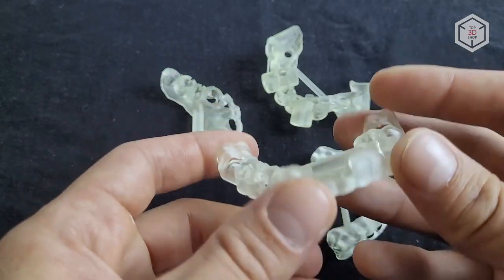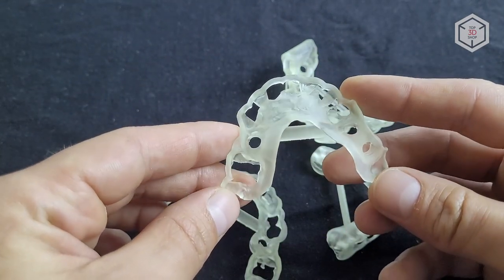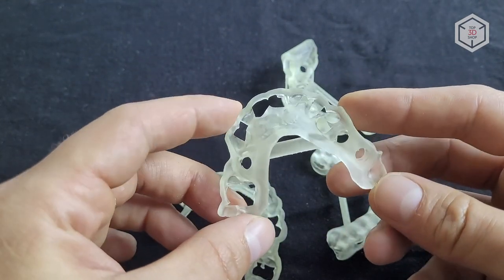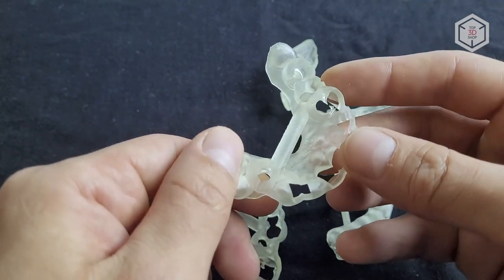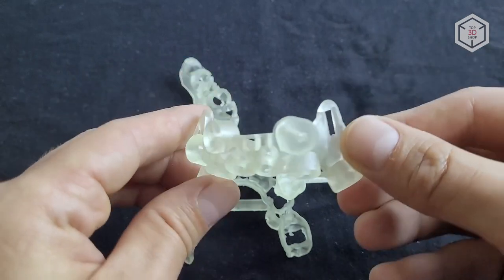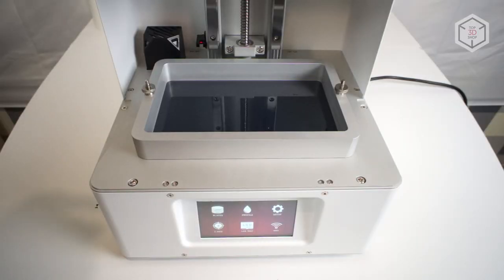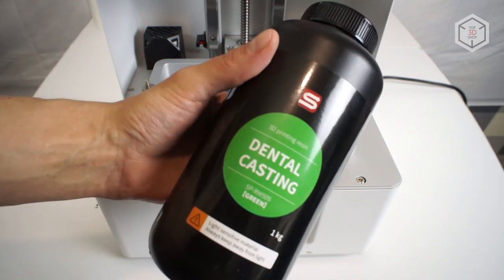Transparent resins usually become slightly cloudy when washed and cured, but it is difficult to show this on camera, and in our opinion, the models turned out great. Even small areas which are essentially defects in the 3D models were printed out successfully, and all the dents and holes were fully cured.